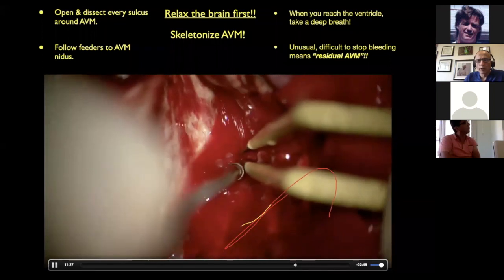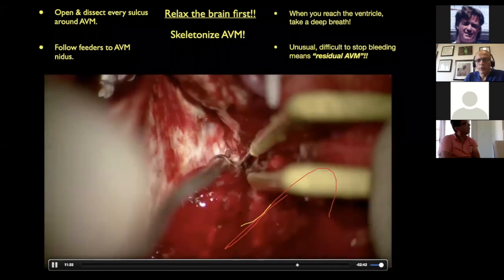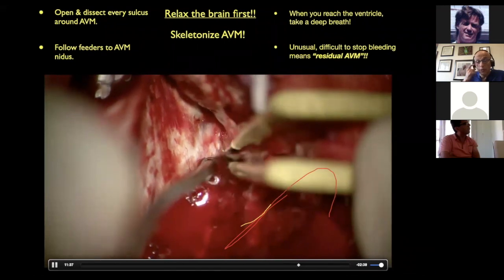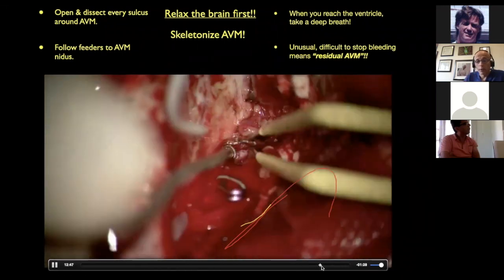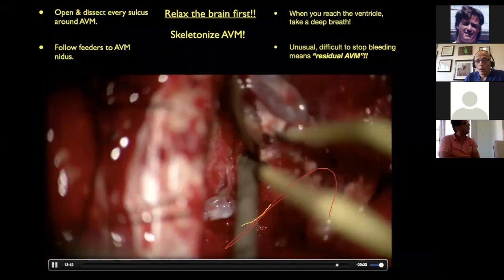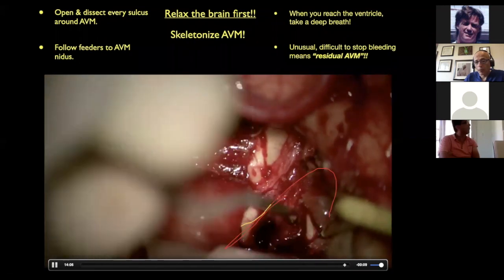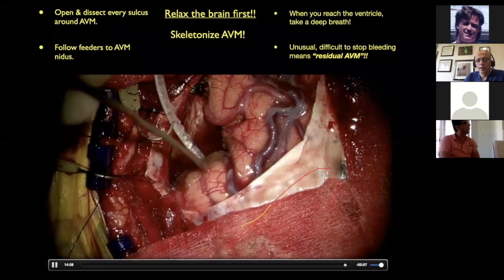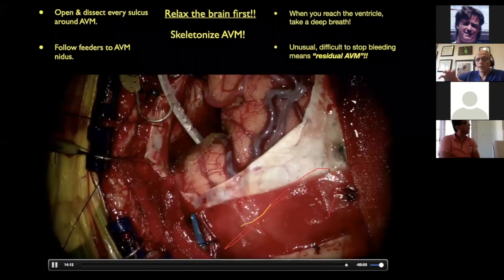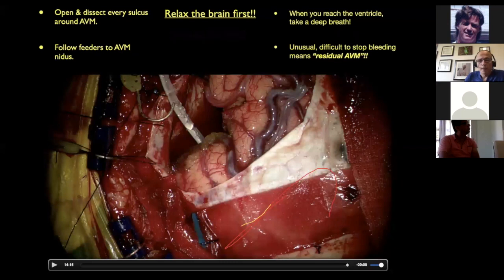There's a bleeding point after I resect the main one. I thought there's a residual, and this is the residual part, bleeding. I will stop that, and I will go to the temporal horn. See, I'm in the temporal horn, suction all that blood, decompress the temporal horn, and put another ventriculostomy into the temporal horn, because sometimes they can have these CSF issues in these extensive bleeds, and one ventricle doesn't work, the other and the temporal horn blown. So you have to be cognizant of that. Okay.